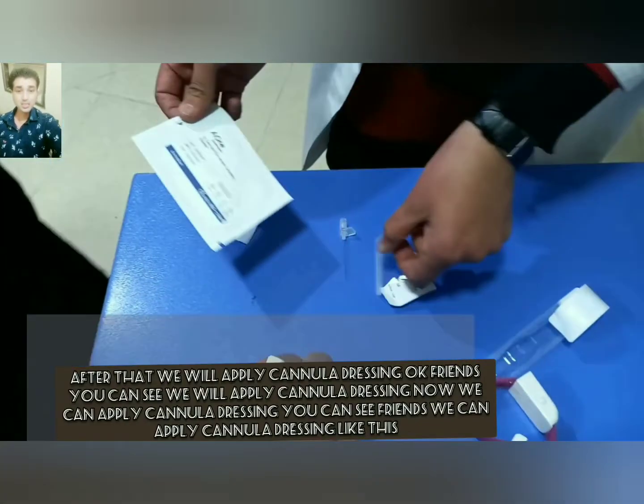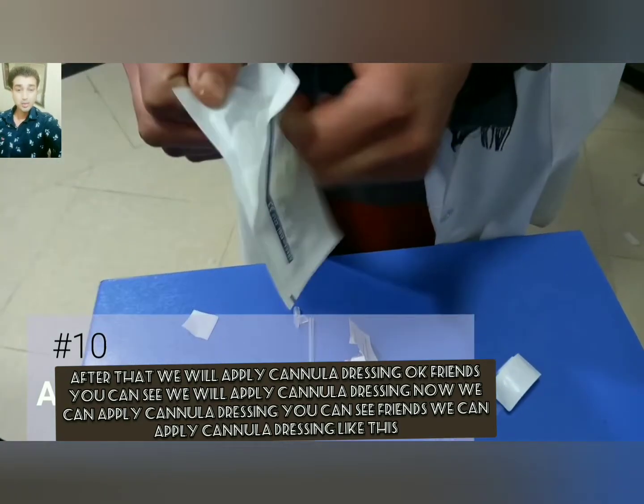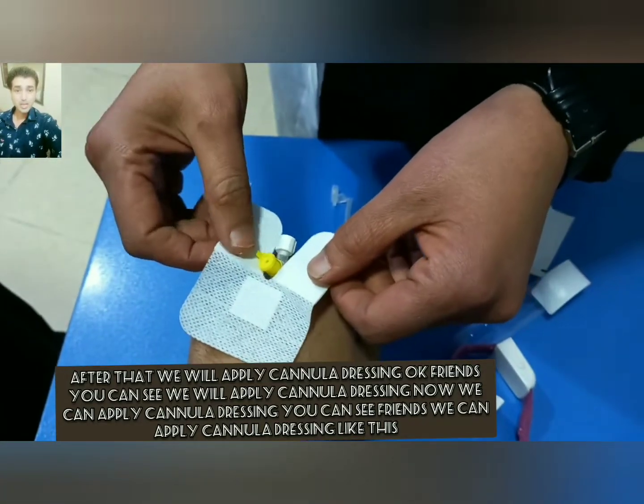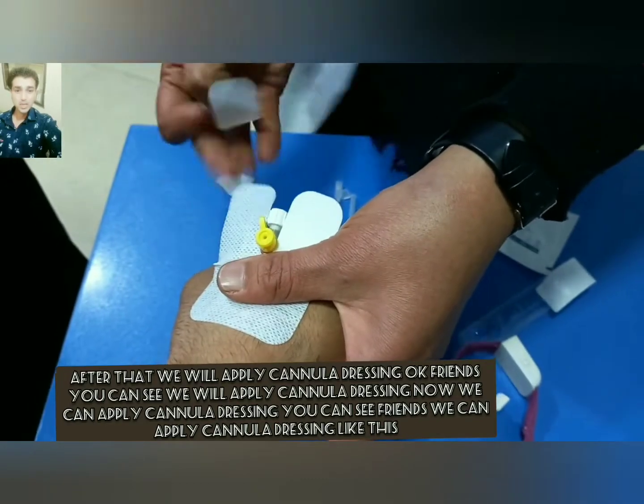After that, we will apply the cannula dressing. You can see we apply the cannula dressing like this.